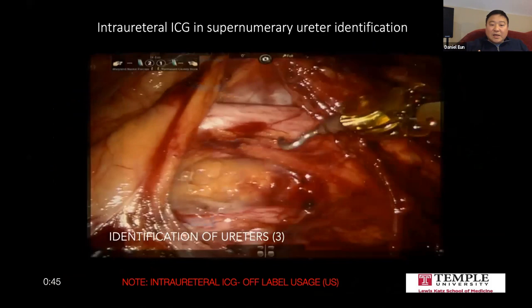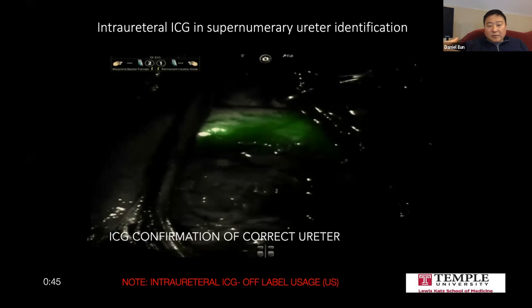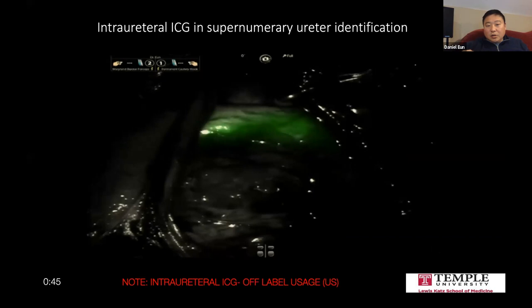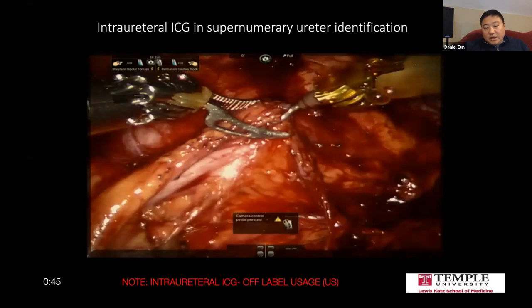And they did follow Weigert-Meyer law, so it was very interesting for us to see the cystoscopic view retrograde. And once we established that the lowermost ureter was going to the uppermost moiety, we injected that with ICG. And here it's like cheating, right? The ureter of interest lights up, the other ones don't. And then we take out the ureter that's glowing green. And it really is helpful in cases like this where you could end up getting confused.